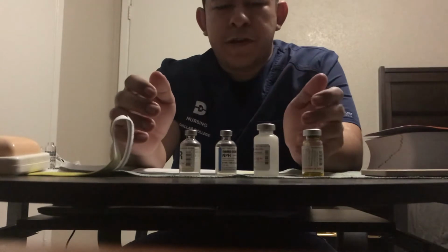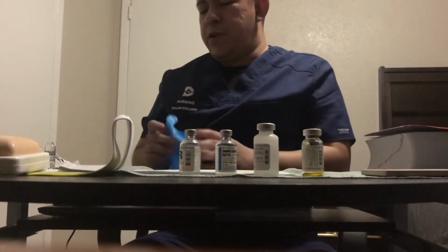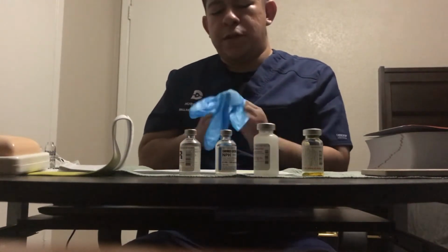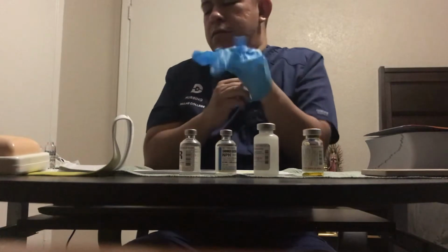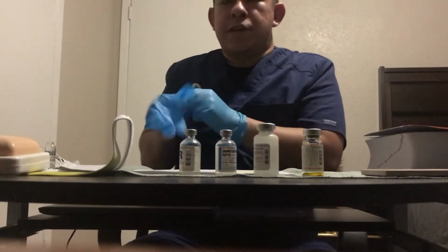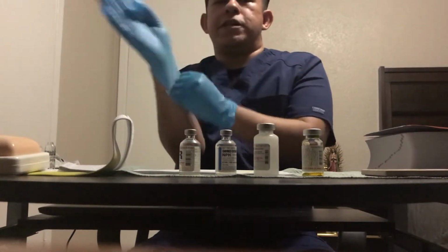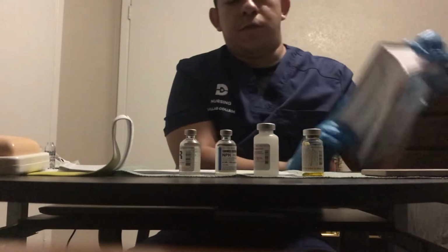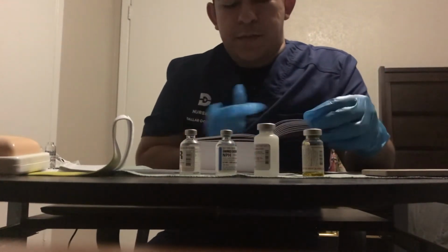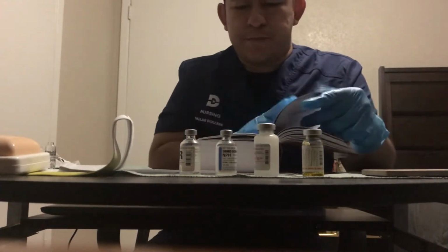The next thing we're going to do is prepare them. Since I already did my hand hygiene, I'm just going to put on some gloves to be safe. And as I prepare my meds, I'll be doing a second medication check as well. Also, what I want to do is grab my drug book and make sure everything is within normal parameters.